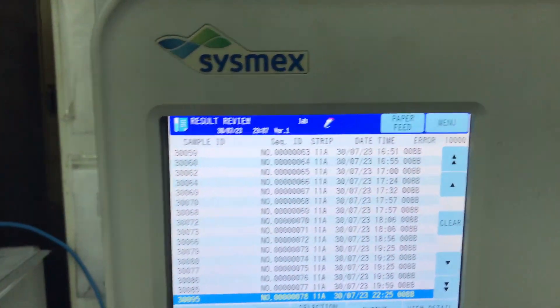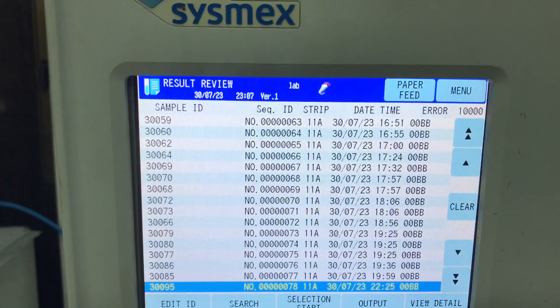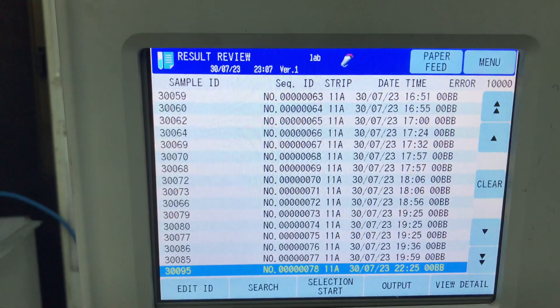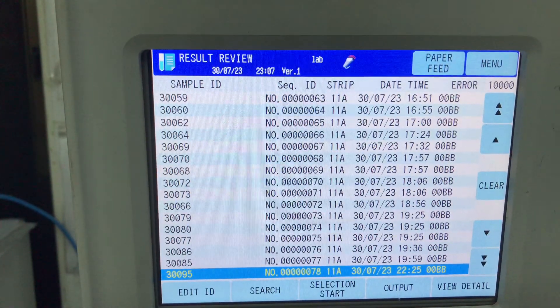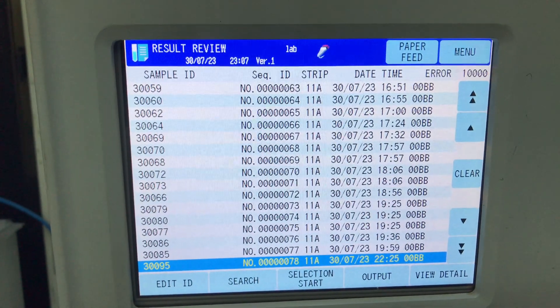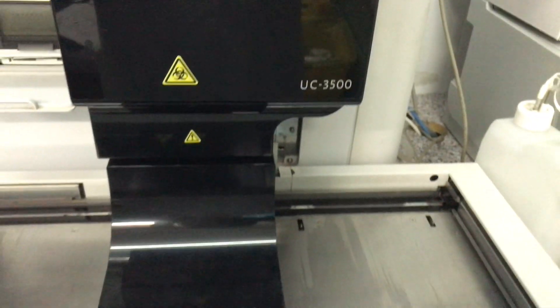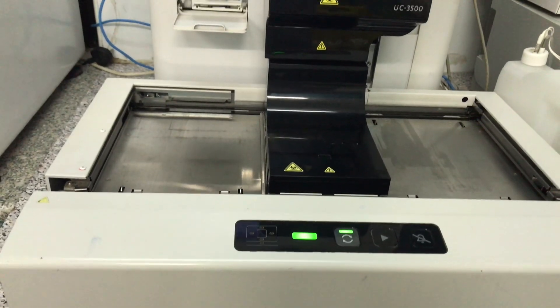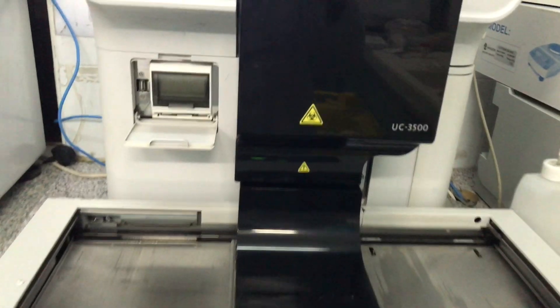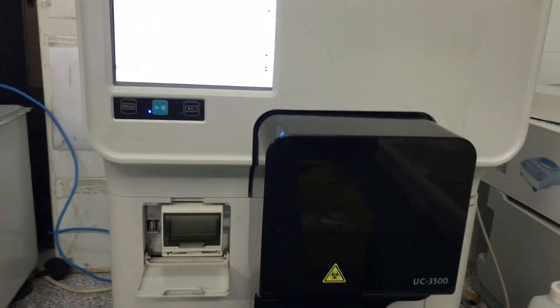Hello and welcome. In this short video I'm going to show you how to use this Sysmex machine. This machine has a fully automated urine chemistry analyzer, so it helps you to do all your urine chemistries in a very quick way. Instead of doing them one by one with the strip, this one helps you to do about 10 at a go, so it really helps when you have a large number of samples — the UC-3500 by Sysmex.